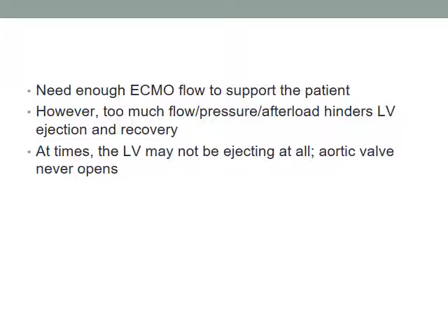So you need enough ECMO flow to support the patient, but too much flow and pressure and afterload hinders LV ejection and LV recovery. And at times the LV may not be ejecting at all, and the aortic valve never opens. That is another problem that can lead to the need to do something called LV decompression. That's also on the list of things that is beyond the scope of this talk.